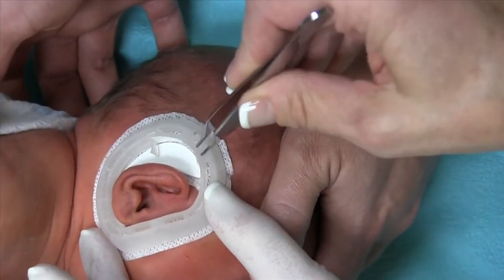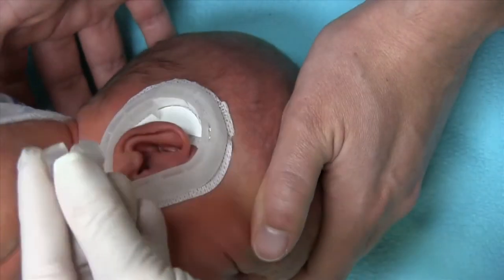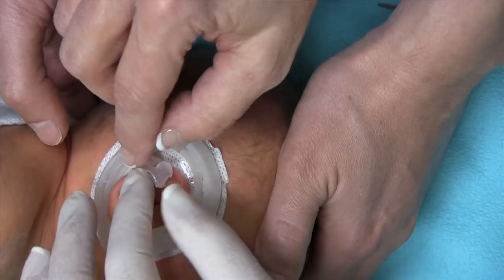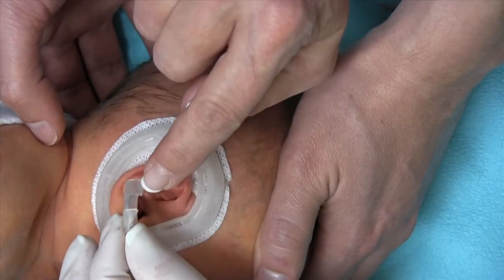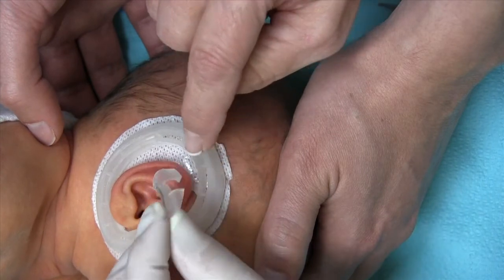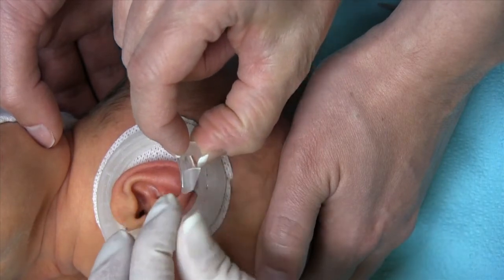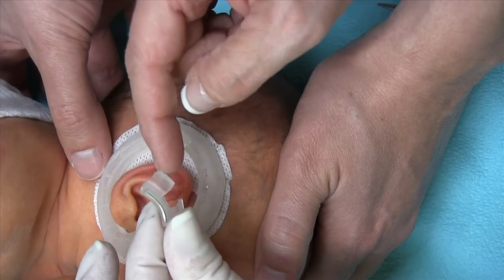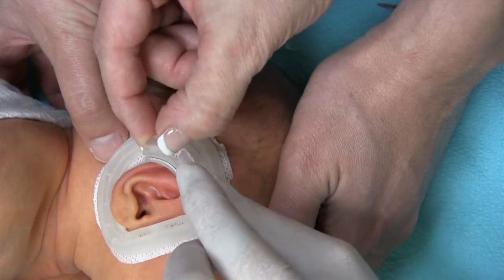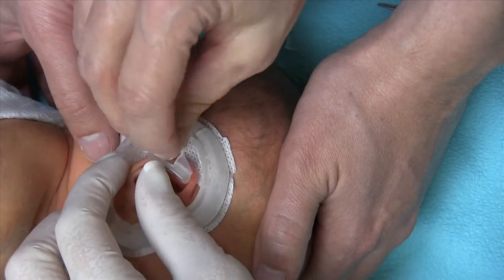We have our cradle in place and everything positioned. We have the posterior former trimmed. What I'm going to do is trim the top of the retractor so that we can put that up a little bit higher. I cut it on the side, so here are both legs of this. I just angled this up because that allows you to move up a little bit higher so you're not bumping into the edge of the cradle, but it also helps decrease the forces. As they move around, these things can shift, but this is going to keep it grounded because the adhesive is going to attach to this leg of the retractor, and this allows it to not have too much pressure going down this way — giving a little bit of relief of pressure so you can position it exactly where you want it.